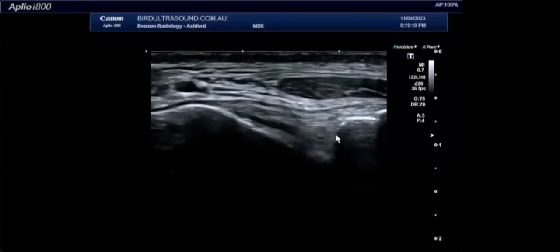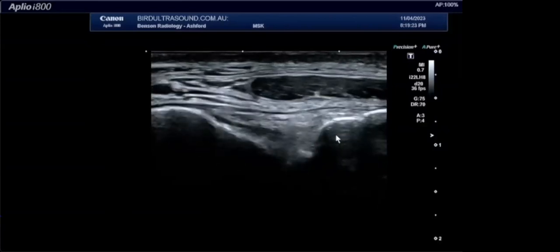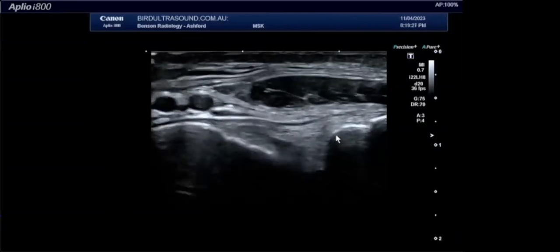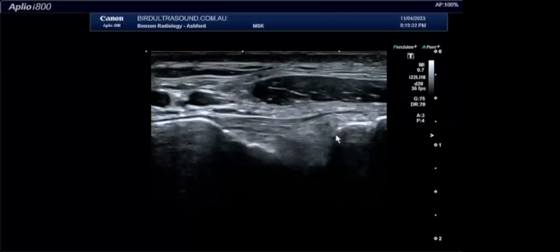If we do a little bit of eversion of that ankle joint, you can see the way that just tightens it up a little bit. So you've got that nice collagen lines down. You can see the attachment. You can see it stressing it there, and then let it relax a little bit. See it hammocks a little bit. Then you can tighten it and see it stressing it again.